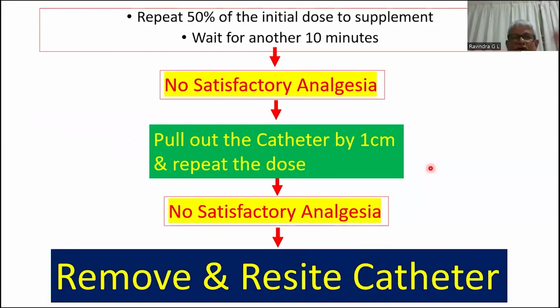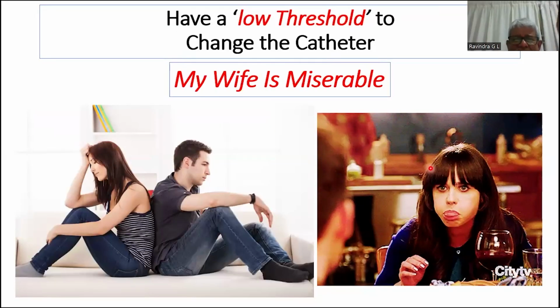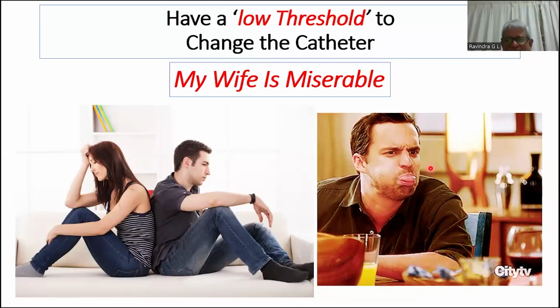This is what we follow most of the times. Have a low threshold to change the catheter. After all, the catheter is not my wife, you see. You can change it anytime.